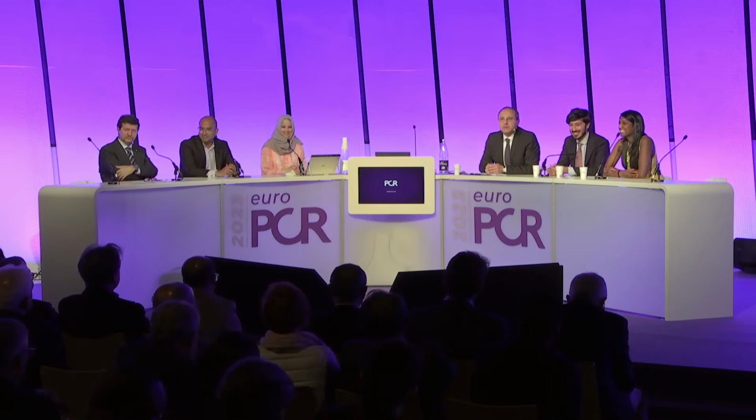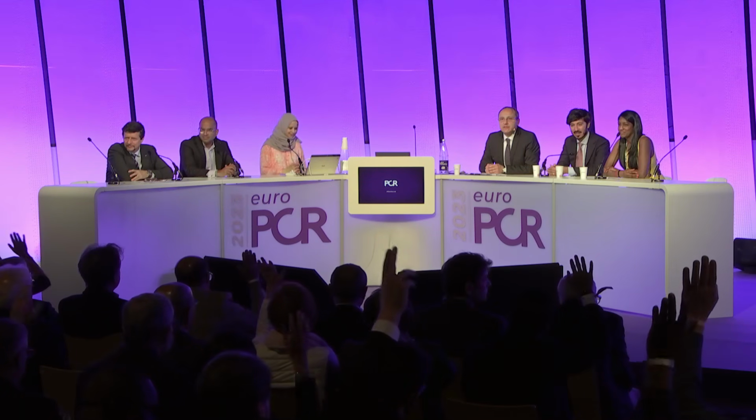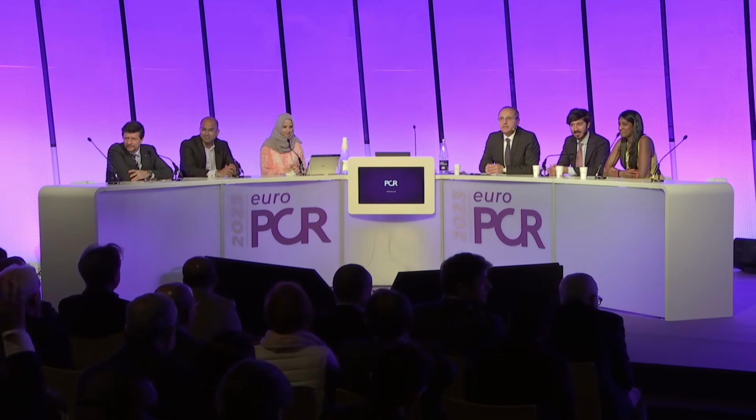1.5 millimeter bar? 1.75 millimeter bar? Who would start with a 1.25 millimeter bar? 1.5? 1.75? It reflects perfectly what's in the panel. Let's go back to Toulouse and see what they used.